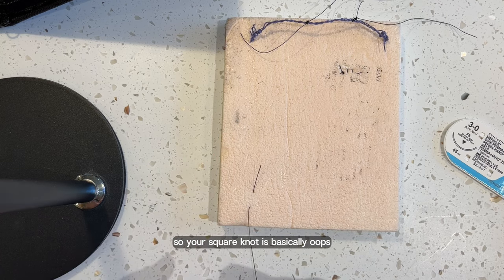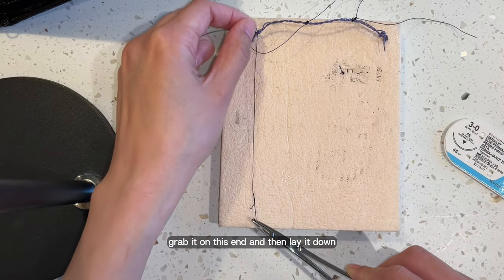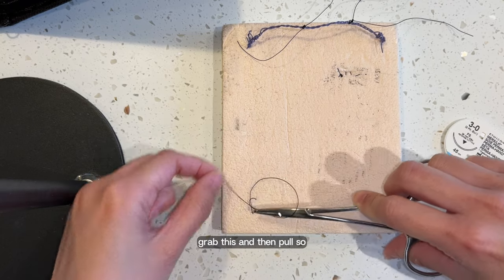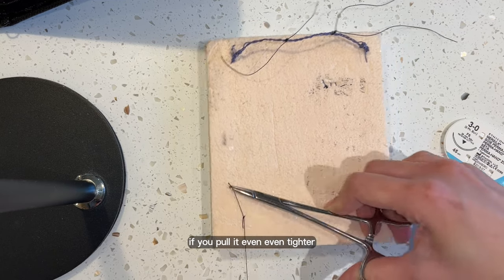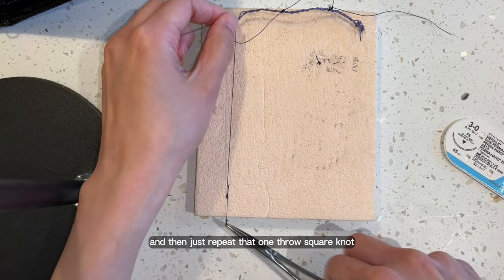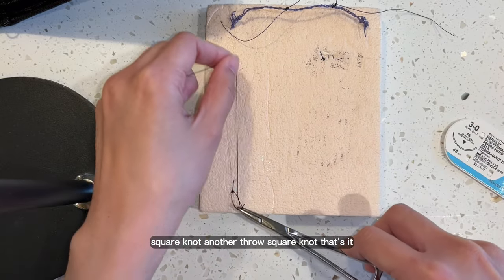Your square knot is basically like one throw — grab it on this end and then lay it down. So you grab another one, do it again. Over this way, grab this and then pull. The second knot will tighten the first knot that you have. And then just repeat that: one throw, square knot, another throw, square knot, another throw, square knot. That's it — that's your square knot.